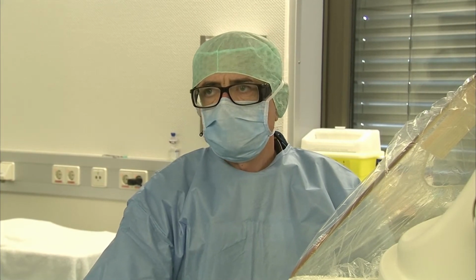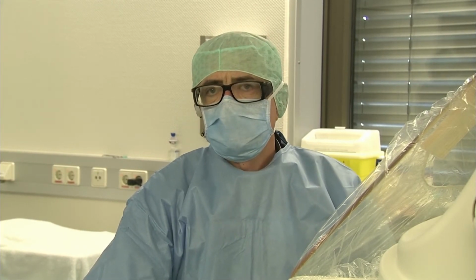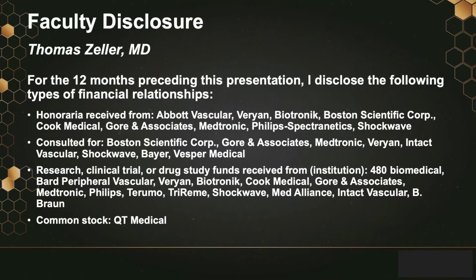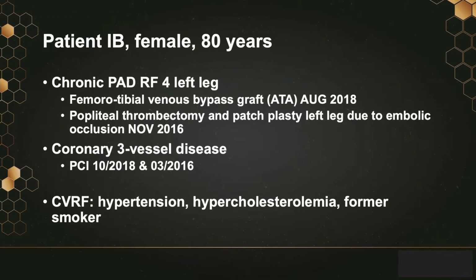I'm here again with an old lady. I would like to introduce you shortly into the case. I feel that this is of interest because this interventional therapy is following a failed bypass surgery. I have nothing to disclose with respect to this particular case presentation.